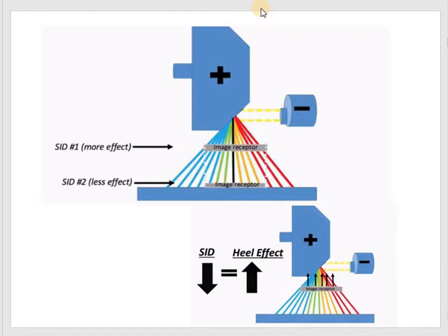There are also other methods to do it. Number one is by using a compensating filter, and you can use a software adjustment to correct the pixel value, so the intensity is factored to a value to correct the uneven X-ray field to a uniform one.